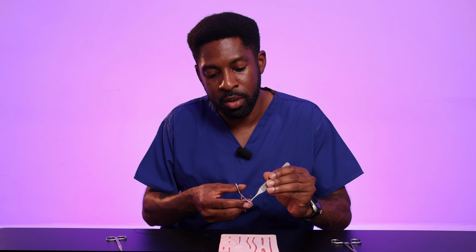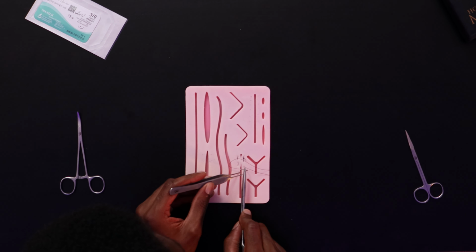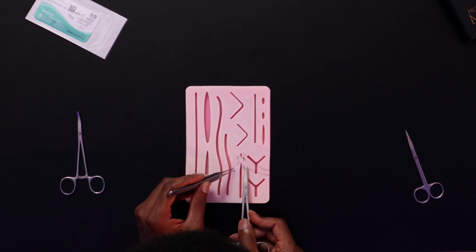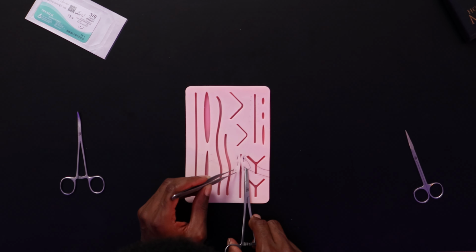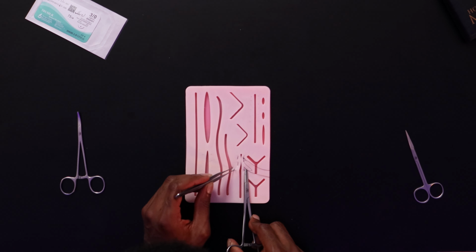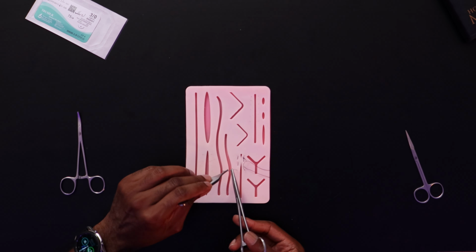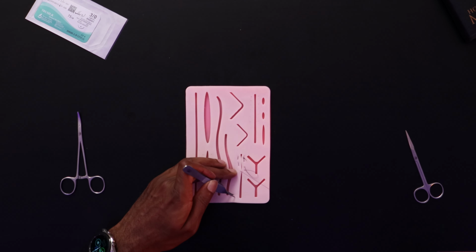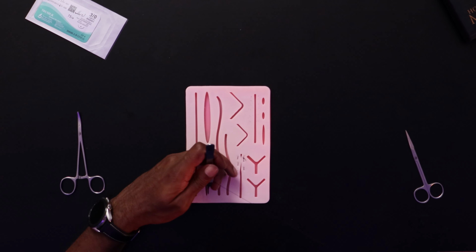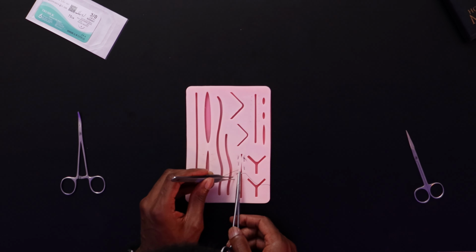ensuring that as you go, you pull through the suture material as tight as you feel that you need it to close up the wound. So a forward suture pass this time. Again, coming out at approximately the same level on the other side. Remount your needle. And perform your backward suture pass.